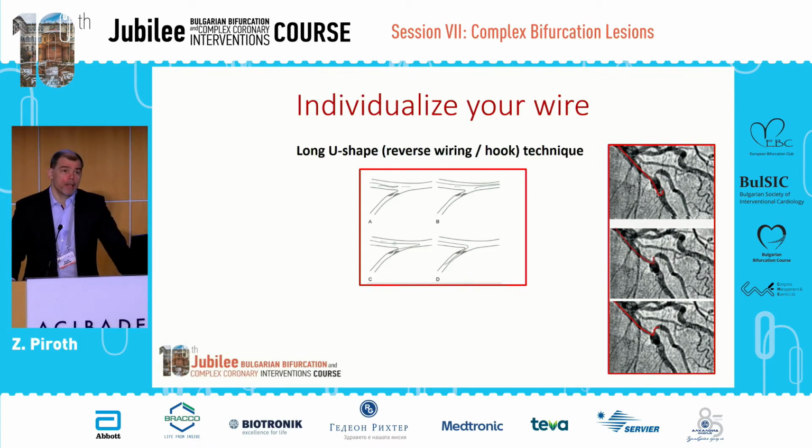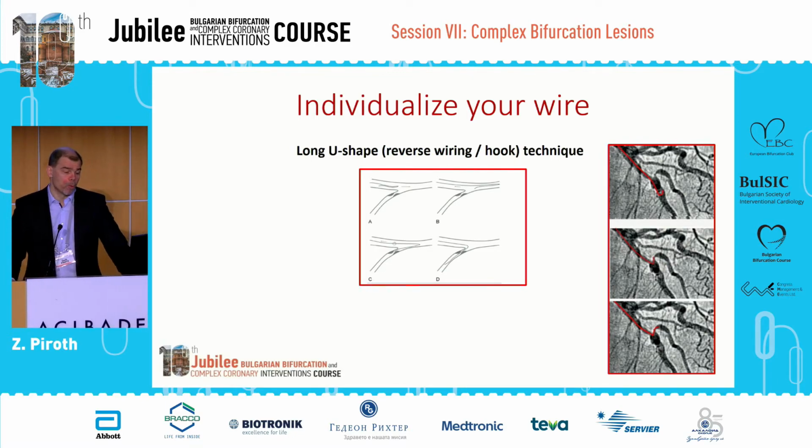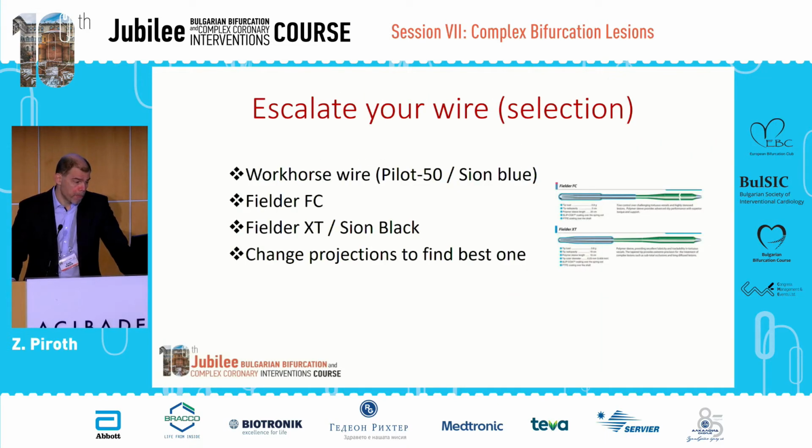But again, even if you're able to enter the side branch with retracting your wire, it's going to be exceedingly difficult to manipulate it and place it and track it down so that you have enough support to place microcatheters or balloons across. So this is sometimes very, very challenging.